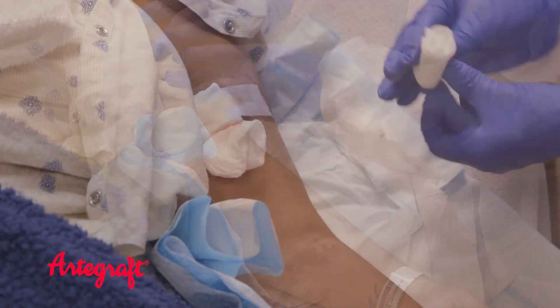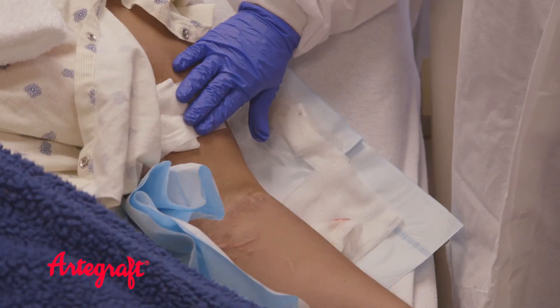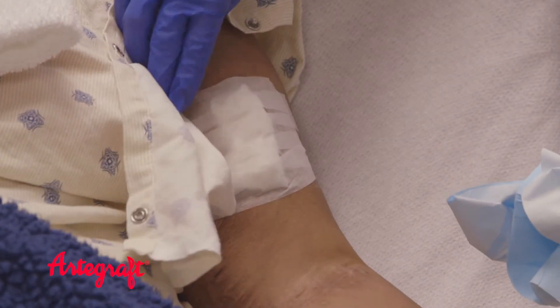Prolonged bleeding greater than the patient's normal time to hemostasis may be a sign of outflow stenosis. Once the bleeding is stopped, you may finish your discharge as directed by dialysis personnel.